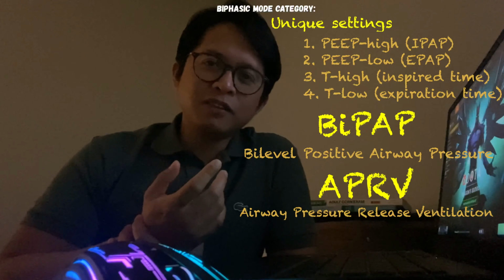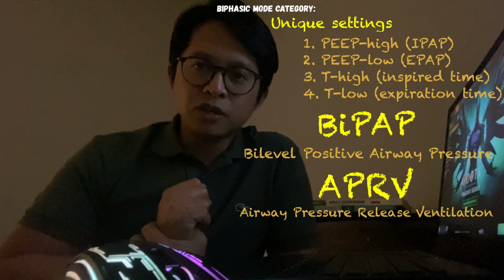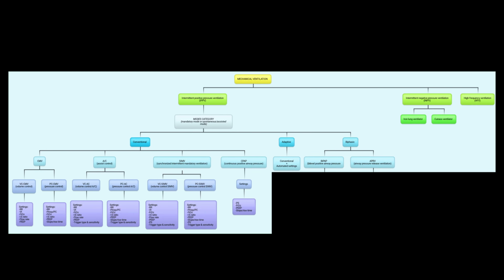We know that the two both perform PEEP alternation. So what's the difference? In BiPAP mode, all mechanical breaths are quasi-pressure control assist breaths or pressure assist breaths. The word quasi means that they mimic pressure control by PEEP alternation.